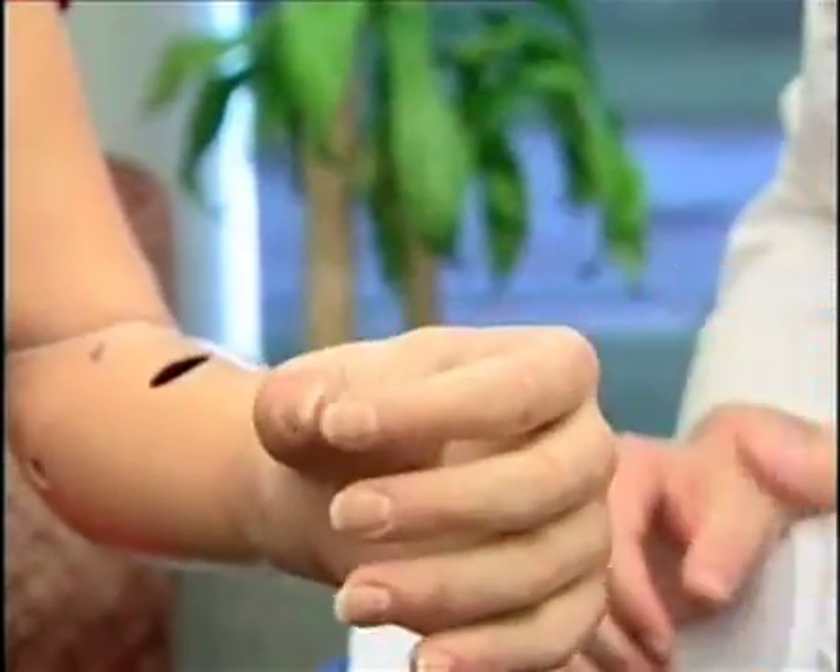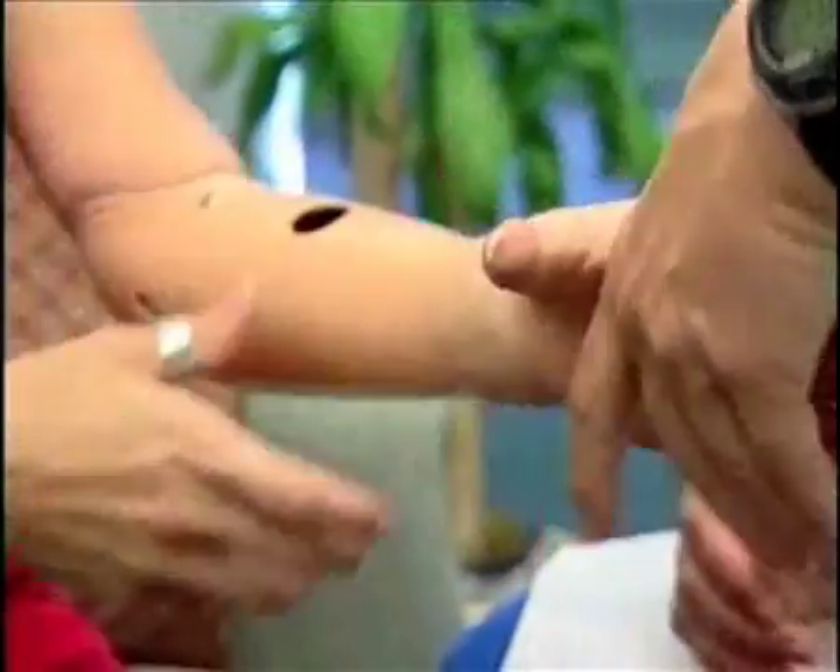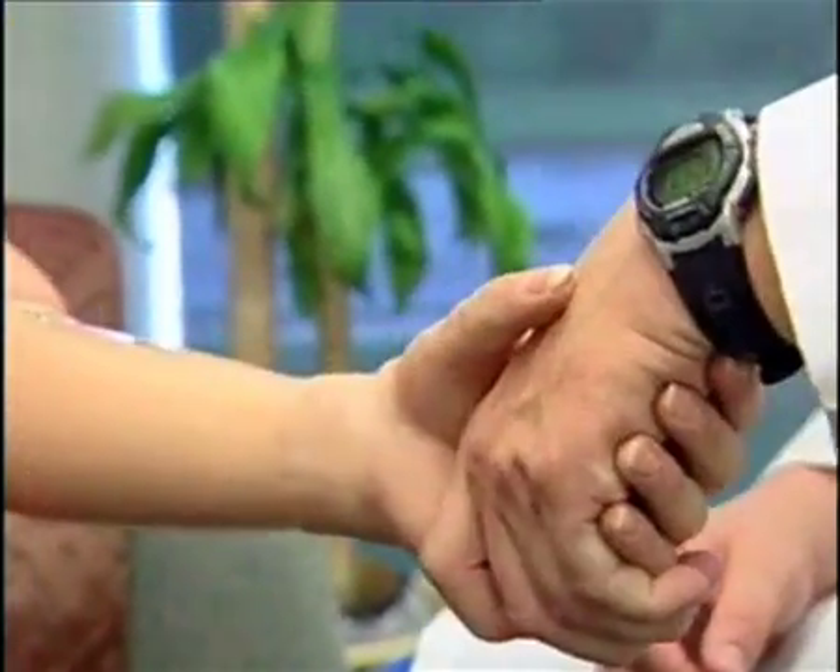We found there are two patient groups for the hand. There are those that want their hand to look as natural as possible, and for those patients we produce a cover — a skin — that is as realistic as possible. That's been a significant challenge that's taken us a while to overcome. There's a second group of patients who like the hand to look like what you might call a terminator hand, and for those patients we have a different skin which accentuates the robotic nature of the hand.